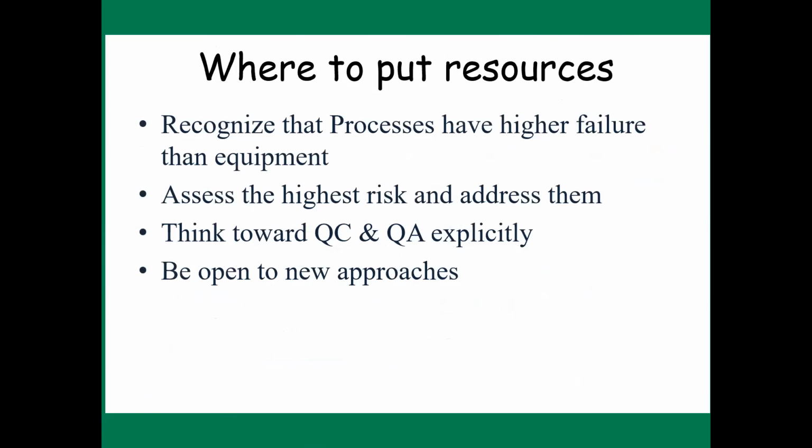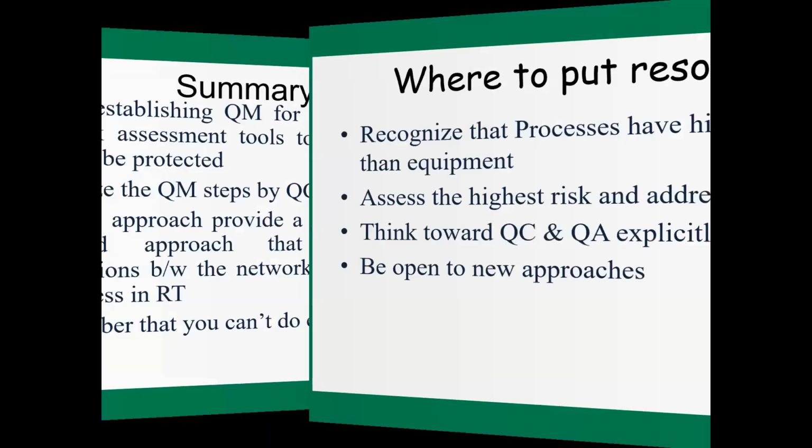Where to put the resources? Recognize that processes have higher failure than equipment. Assess the highest risks and address them. Think toward QC and QA explicitly. Be open to new approaches.